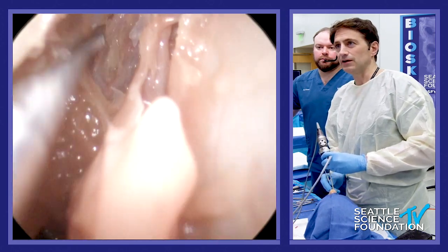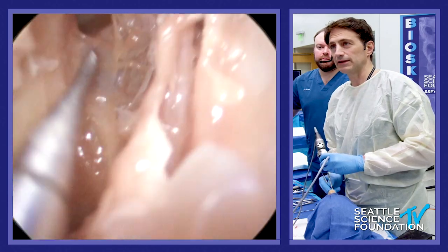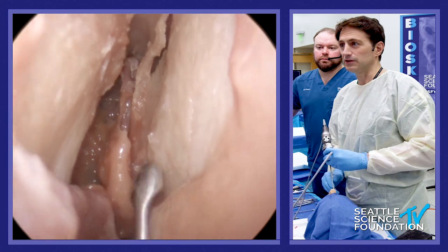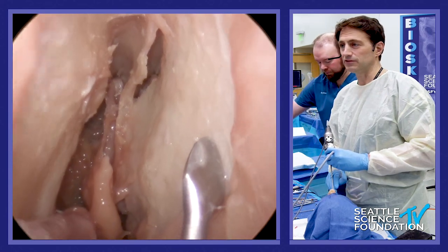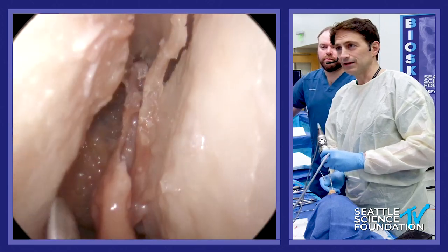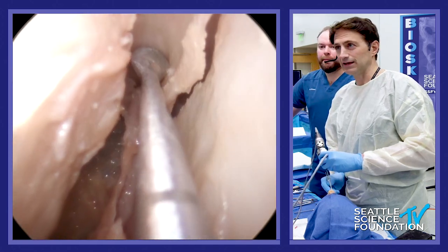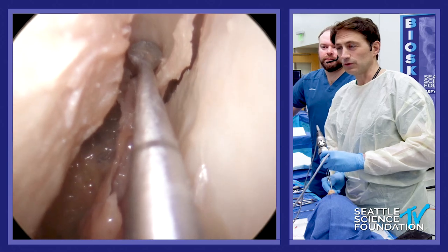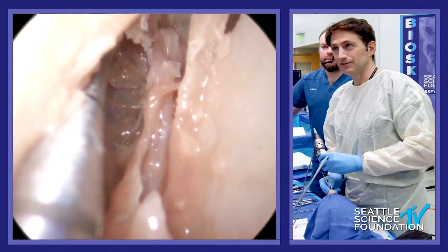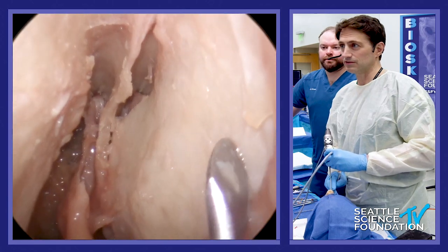The idea here is that when I dissect with my residents, they'll open the frontal like a natural 70-degree dissection this way, and then I raise my flaps and I'm good to go. It's very very simple and very easy — this is by far the greatest way to do it. Hardest part is raising these flaps, by the way. Once you've got this, you can use a zero-degree scope, get in around the corner, and it's actually not really an outside-in — which is basically drilling up into the frontal sinus essentially blindly following the periosteum — but actually an inside-out using a zero-degree scope. It's a little variation of the technique.